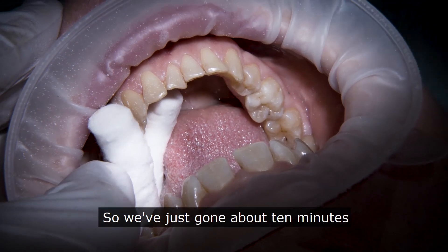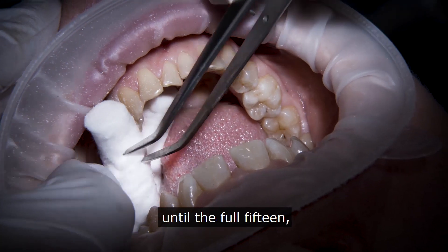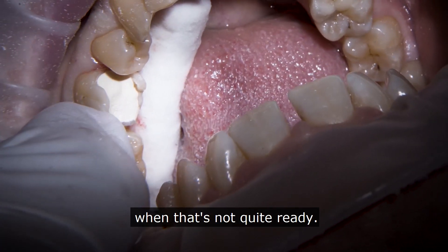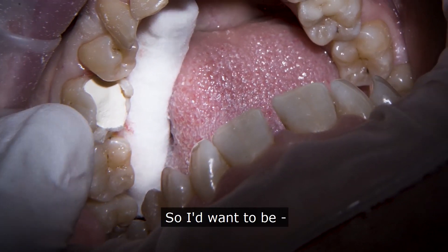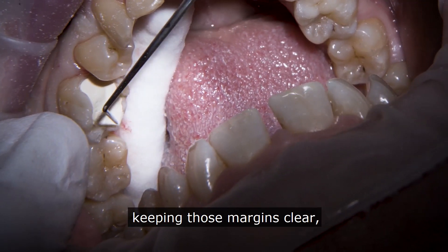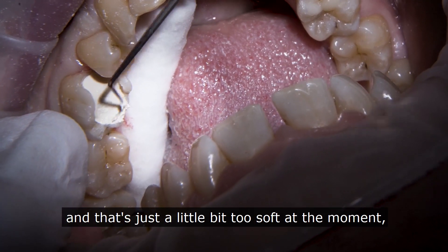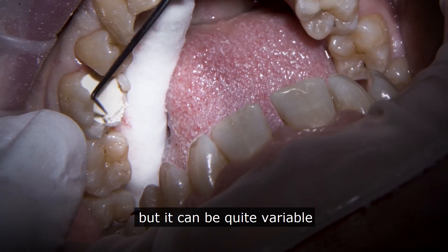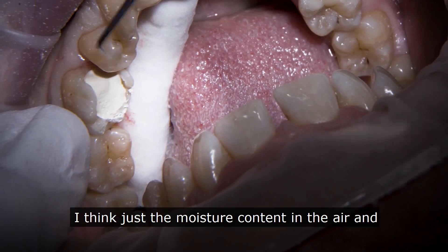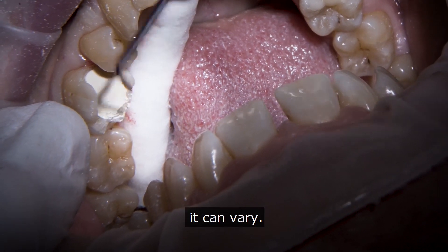We've just gone about 10 minutes with this biodentine. Normally I'd still leave it alone until the full 15, but I wanted to show you how I'd know when it's not quite ready. If I want to clear any margins — that's worked quite nicely keeping those margins clear — I'd do it with my probe, but that's just a little bit too soft at the moment. We use the timer as a guide but it can be quite variable; the moisture content in the air and in patients' mouths can cause it to vary.